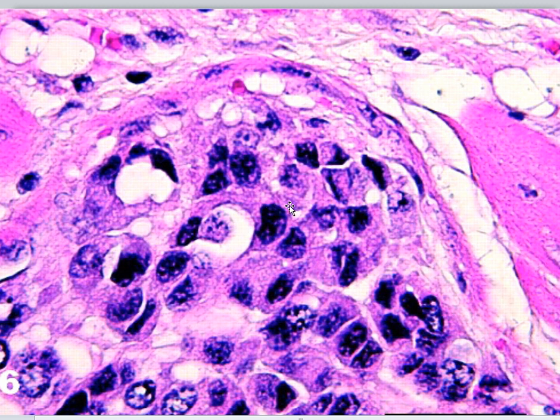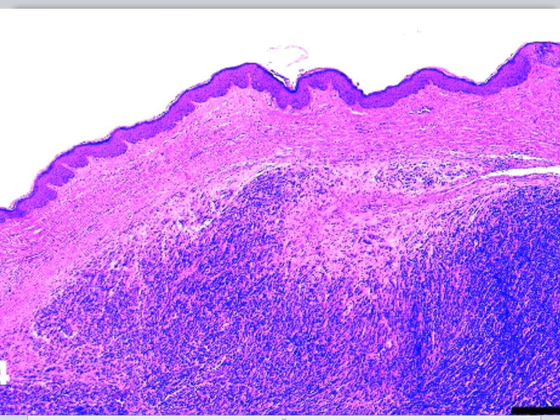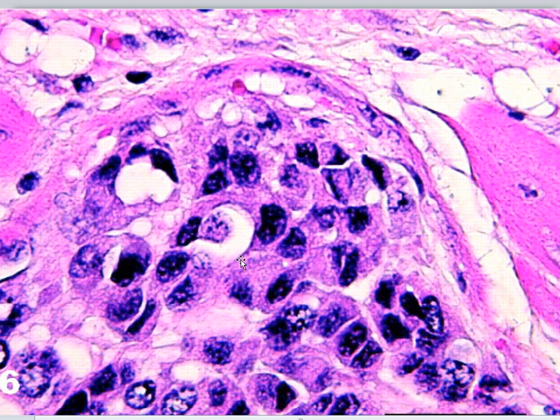And if that is not confusing enough, whereas I mentioned in this slide the tumor looked like a lymphoma, and in this slide it looks like a carcinoma, the actual studies from Science make it appear that the cells themselves may be of neuroendocrine origin, or perhaps Schwann cell, which is regarded as a type of neural crest derived cell as well.